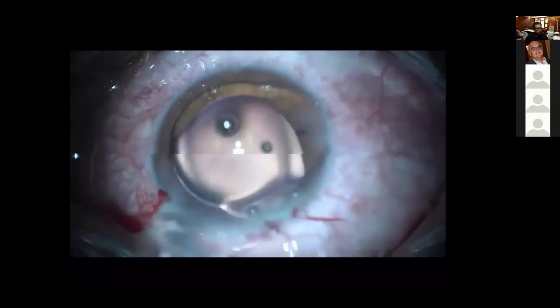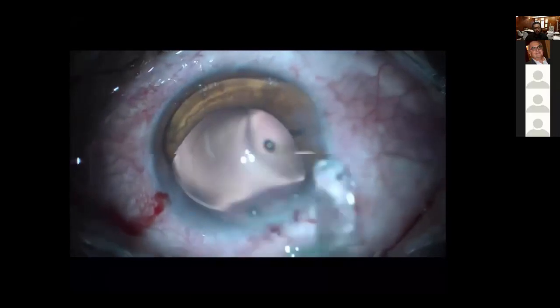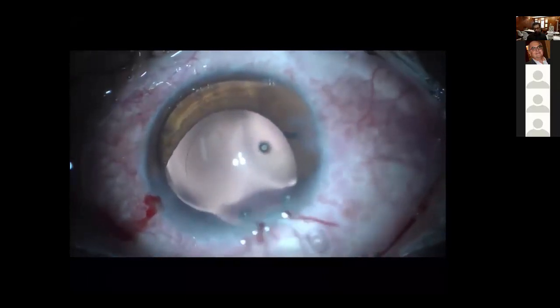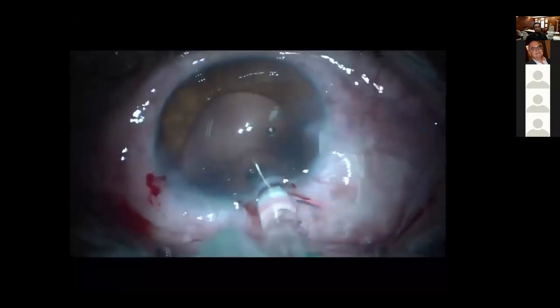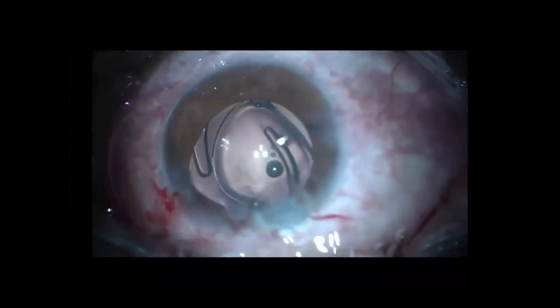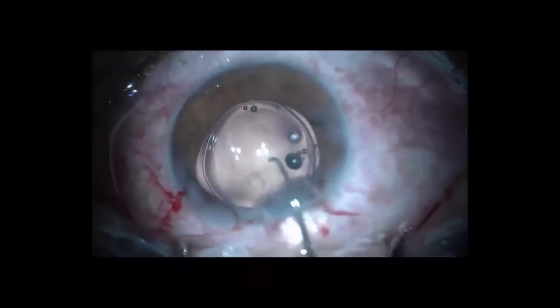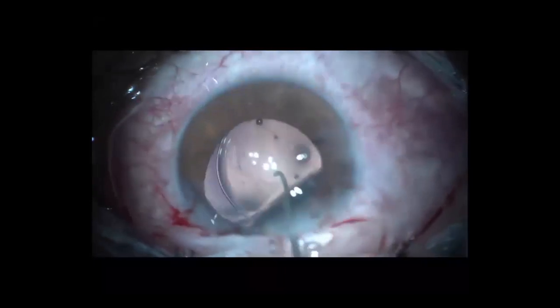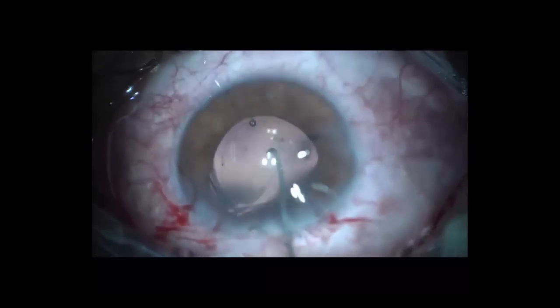You will see here. You aim directly inside the bag. Be careful that you should inflate the bag with viscoelastic. A huge amount of viscoelastic is required, especially when you are trying to introduce the second lens. This is the first lens.